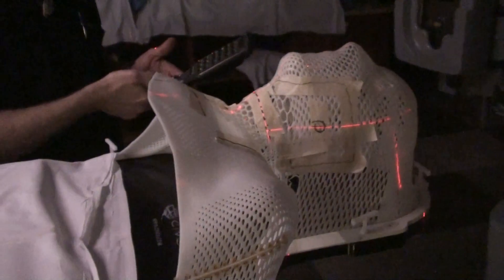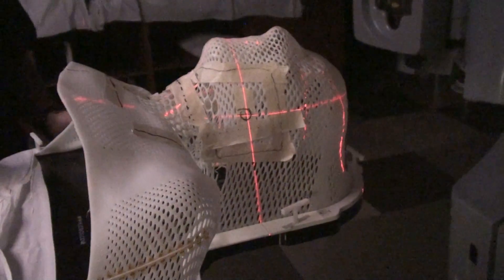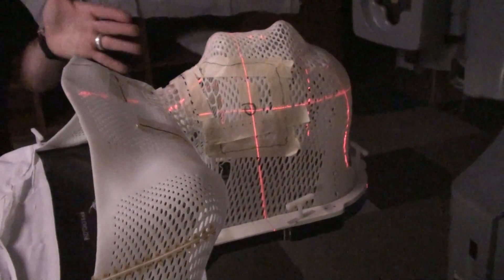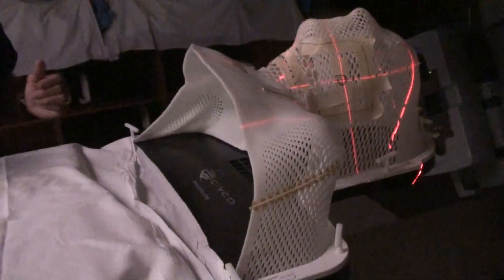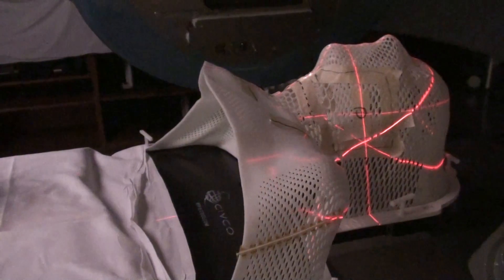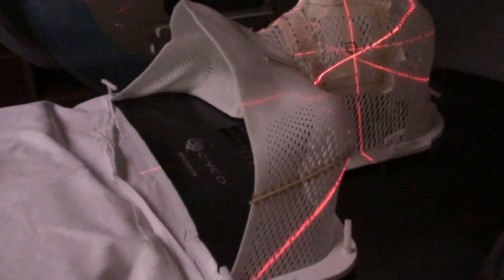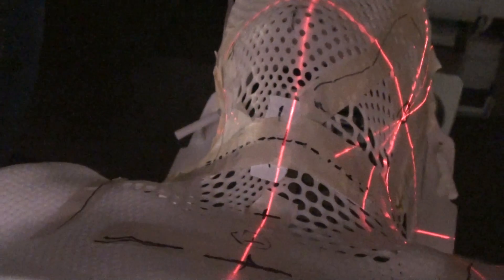We're not too worried about the superior, but on the inferior we could be. So we're going to move to our CR, and I'm going to rotate toward me so that you hopefully will be able to see some of this. Once we get rotated over, you're going to see that we've got an inferiorly diverging field. So we've got kind of a problem — you can see that since our field diverges, we're going to turn the other ones.